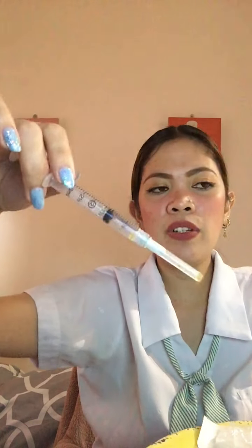So do not move the syringe. Then pull back the plunger. You have to aspirate, to ascertain that the needle is not in the vein. You have to aspirate to make sure that the needle did not hit the vein.